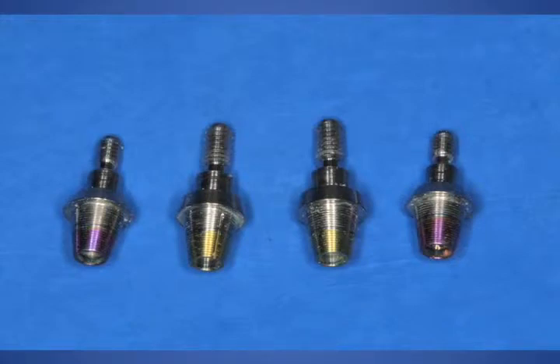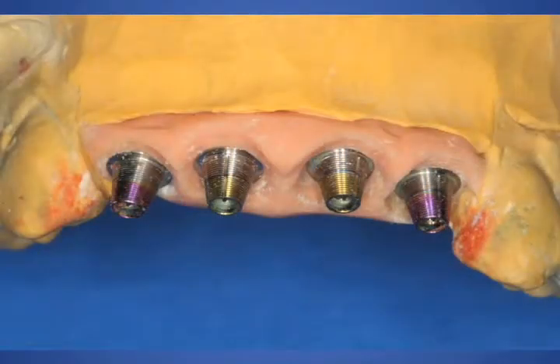We would use transitional abutments in this situation. You can see they're conical in shape, which would allow us to place our final transitional splinted crowns the day of surgery. So these are transitional Nobel BioCare abutments that, again, this is all done preoperatively by the dental laboratory.